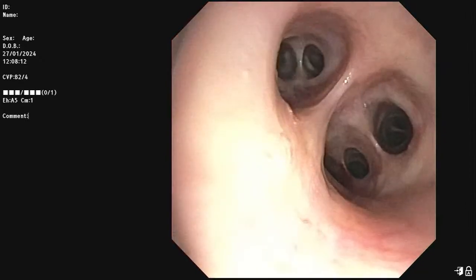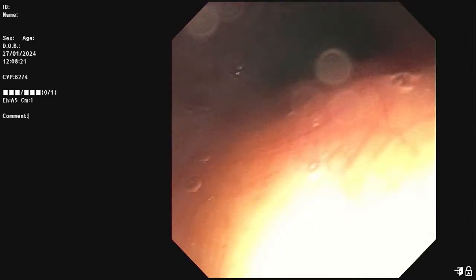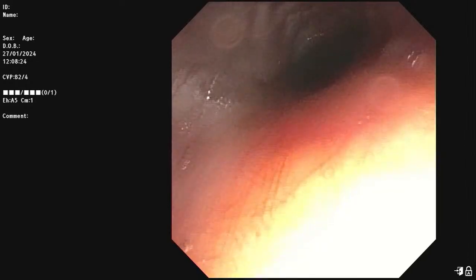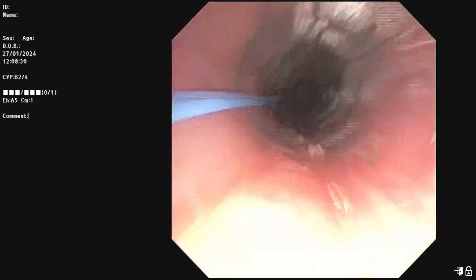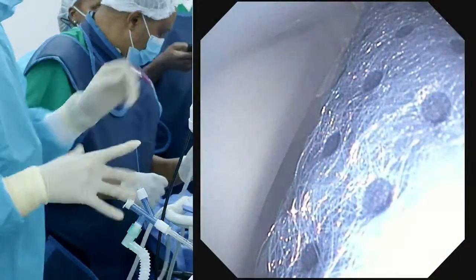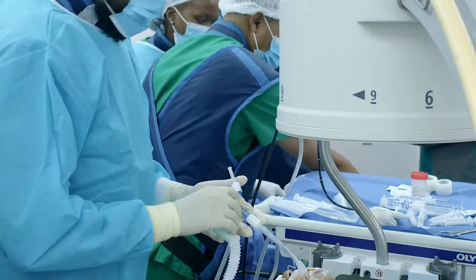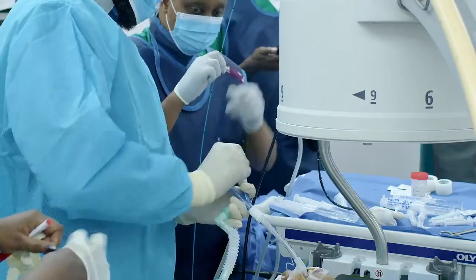You want to connect directly? Yeah, let's connect this one. Come on, come on. Okay, so I'm gonna come up so that the balloon can go in now. Then I'm gonna chase. Label this. Yeah, bronchial wash. Let's put that in. You're doing well. Thanks, man.